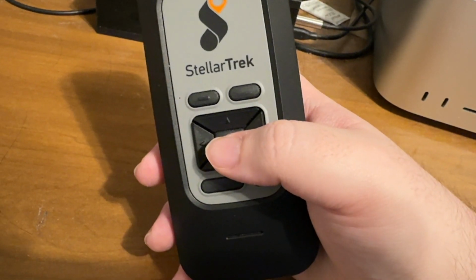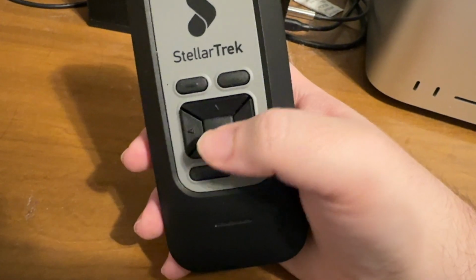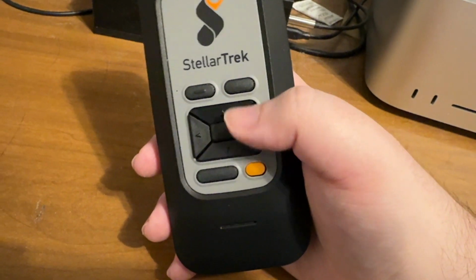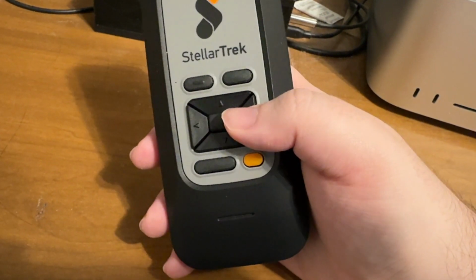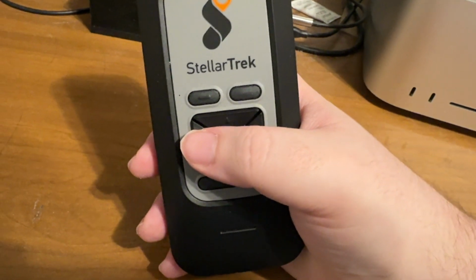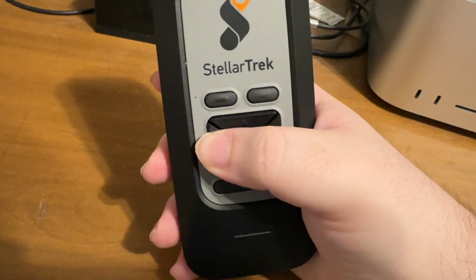We want to do an H, so I'm going to press the down arrow once. A. There's A. So I will press the right arrow a few times and we should get to H. S. D. F. G. H. There's H, press confirm. Next I want an A, so I'm going to press left arrow till we hear the A. G. F. D. S, A.